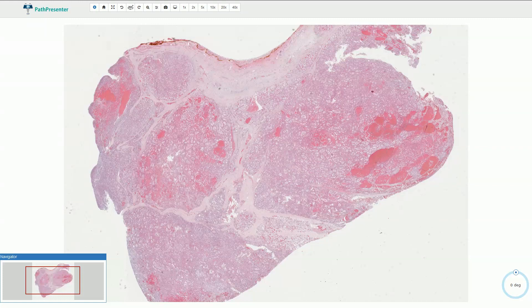Alveolar soft part sarcoma is a soft tissue sarcoma which usually affects young patients. On low magnification we typically see fibrous septa which divide the tumor into nodules or compartments.